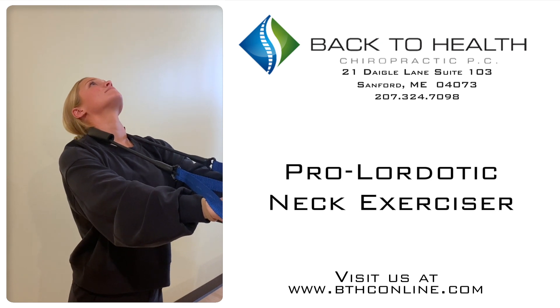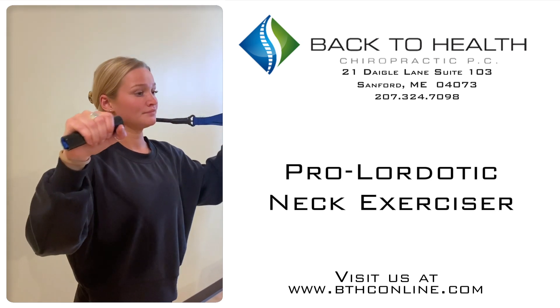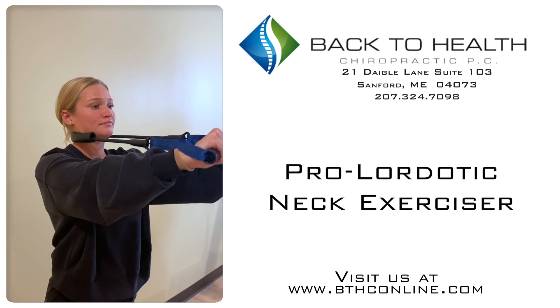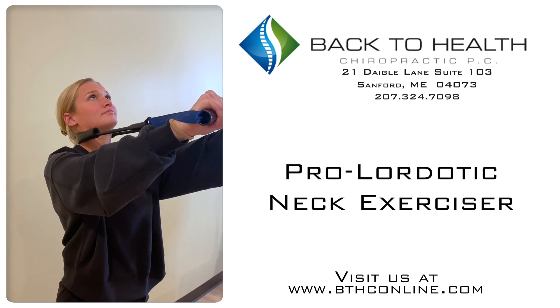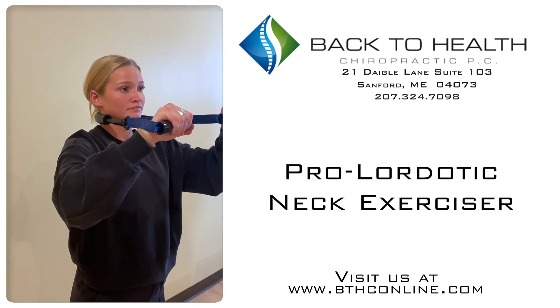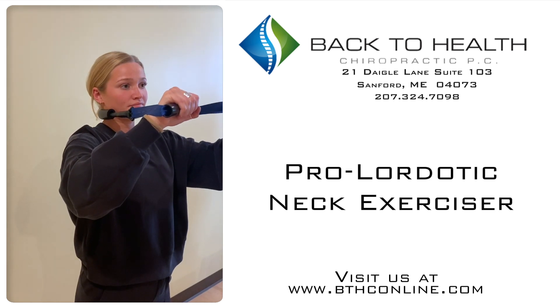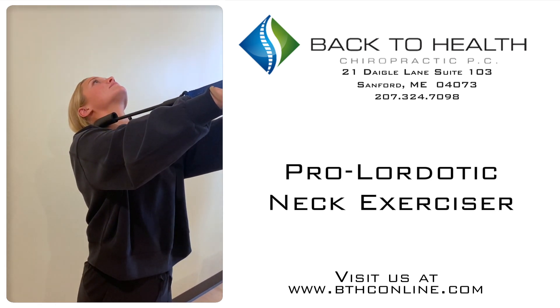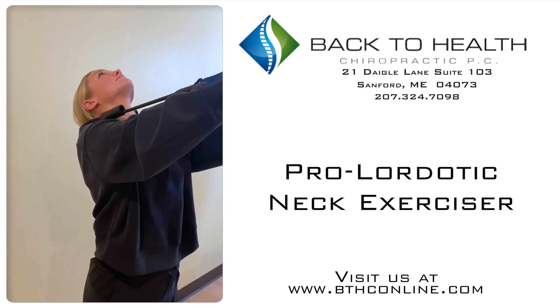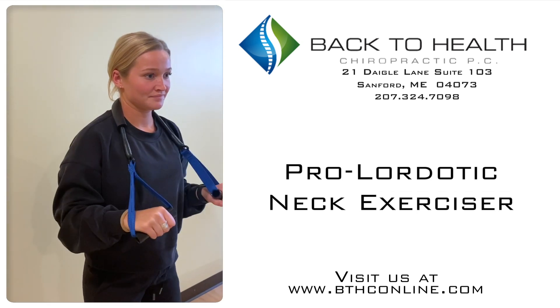After 10, she would rest there. Then the last spot is we would work the band up to the base of the skull. Here we're going to extend arms about 45 degrees above horizontal, extend our neck all the way back, and then rest arms and neck at the same time. We'll do a pumping action here — 10 reps in this position. Once she finishes 10, she would come back to the original starting point, working the Pro-Lordotic all the way down.